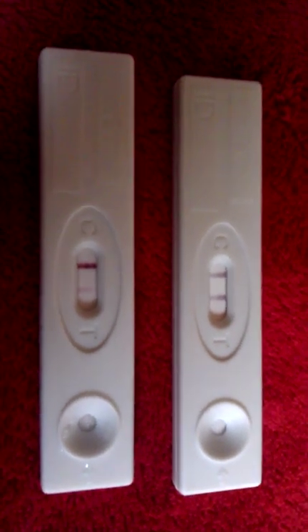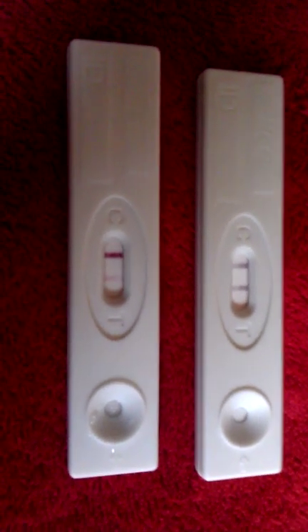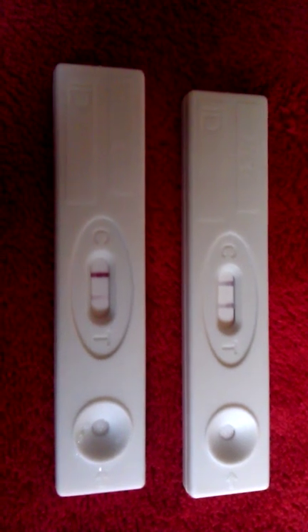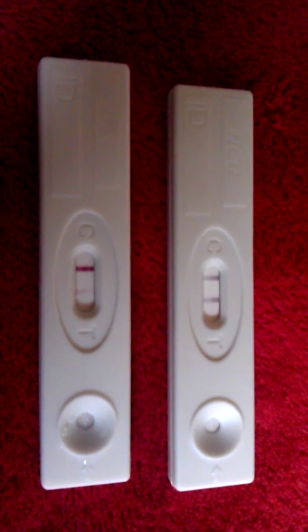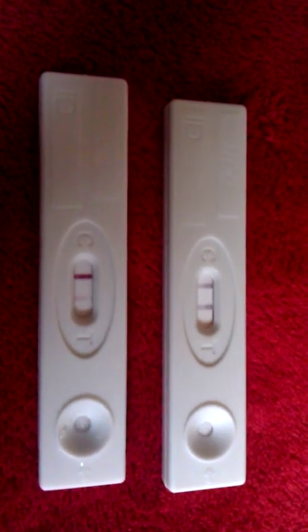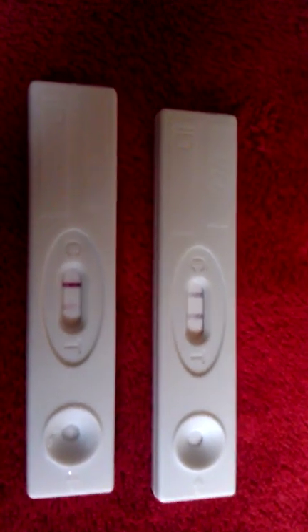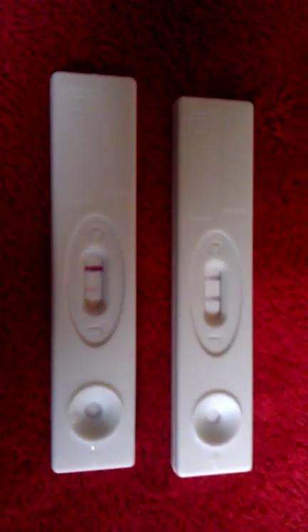It was pure white on the other side when it was negative, but as soon as I put the real pregnancy hormone in there, that light line came up. That surprised me because I thought once a pregnancy test has already been used, it's probably no good anymore. But it did show up — light, probably because it was after the fact, but still. I thought that was super interesting.